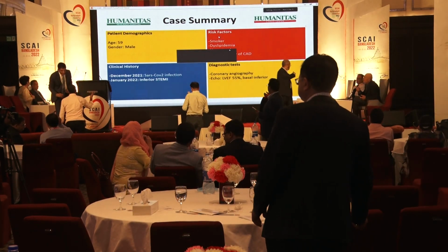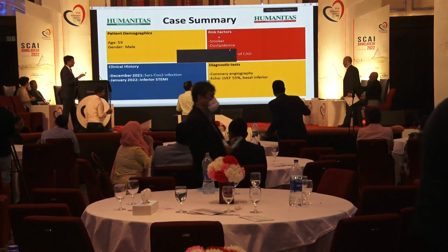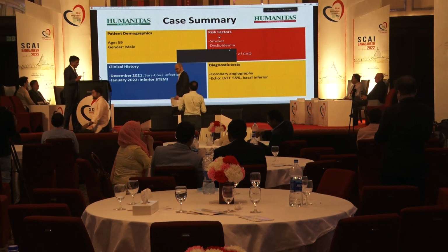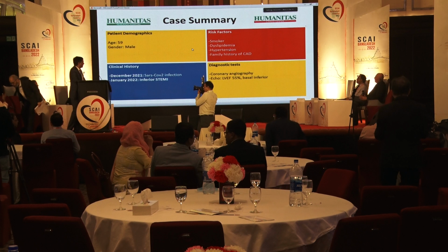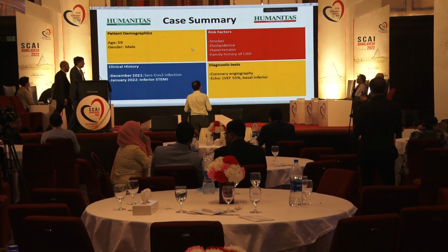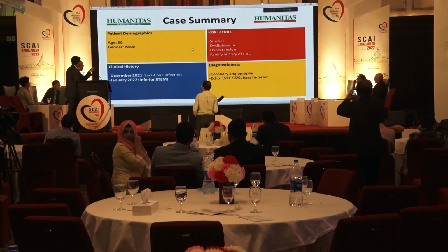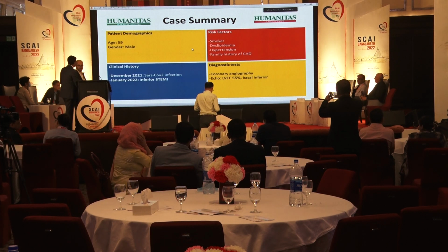Sure. Okay, I have Damiano Regazzoli on my left, who is going to present this case, and then we will discuss the strategy. Damiano? So first of all, welcome to Milano. It's nice to have you here, and thank you for the invitation. We are talking about a young male, a 59-year-old male with smoking, dyslipidemia and hypertension that presented with ST elevation some months ago, and with a normal ejection fraction and almost a normal ventricle.